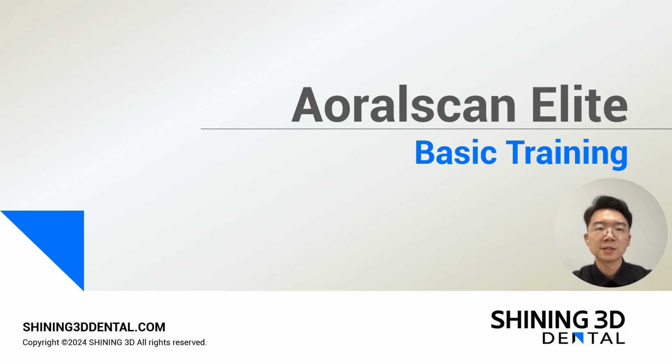The second part is the Elite workflow part. In this part, we will do a comparison between the Elite intraoral photogrammetry solution or workflow with the conventional impression workflow, the digital impression workflow, which refers to using the normal regular intraoral scanners to do the full arch fixed implantation cases, and the third one is the photogrammetry, or you can say extraoral photogrammetry solution workflow.